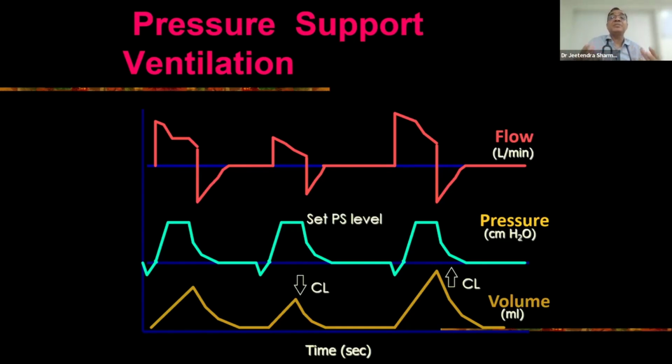Now your lung becomes better and better in terms of elasticity, because water is coming out and the stiffness goes away.